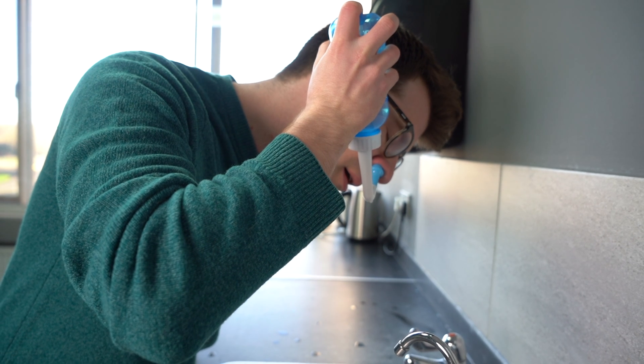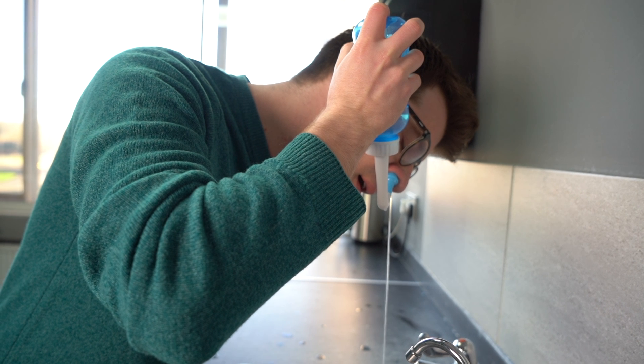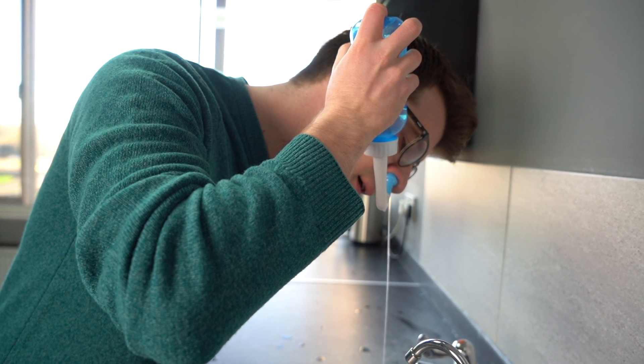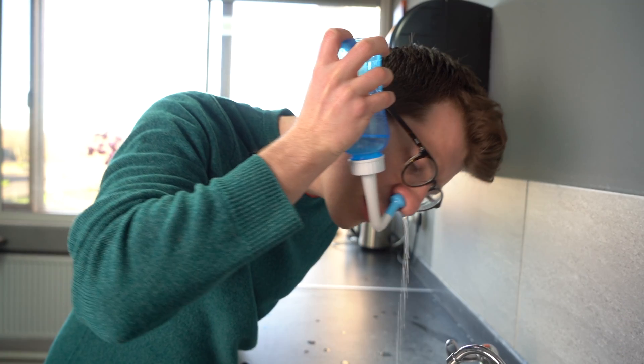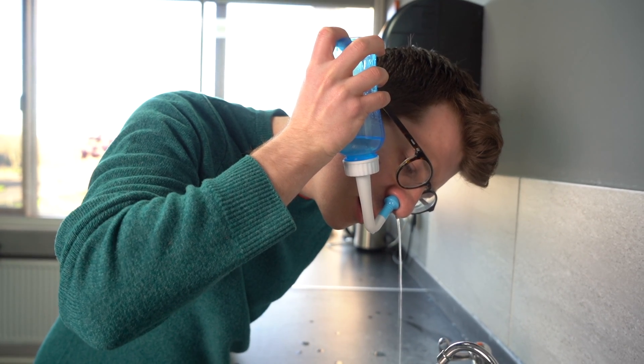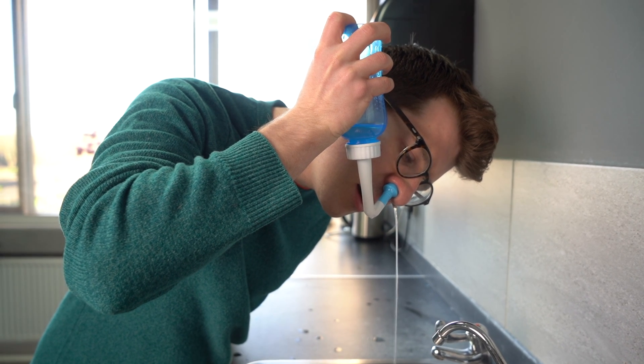Once you're ready to start the wash, stand over the sink. Turn your head at a 45-degree angle, look down ever so slightly, and put the spout into the higher of the two nostrils. Once you're ready to begin, press the valve at the top of the bottle. Water will then begin flowing through the lower of the two nostrils. It's important that you continue to breathe through the mouth during this whole process. Continue to run the solution into your nostril until the bottle is empty.